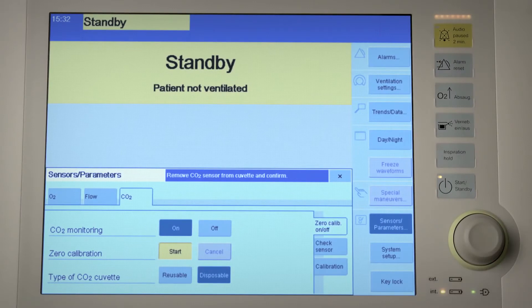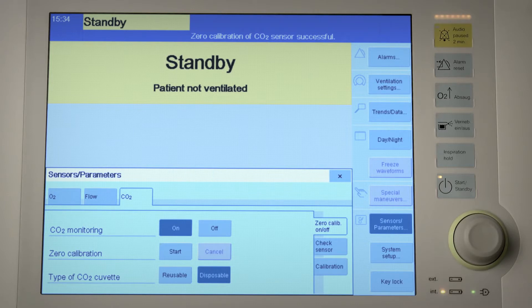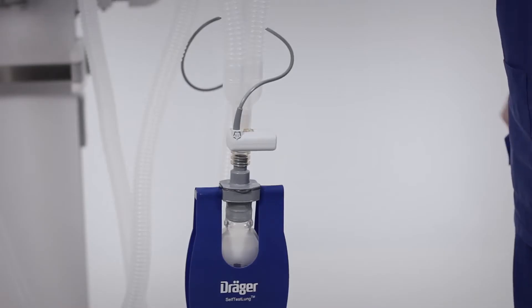If CO2 monitoring is used, check the CO2 zero indication. The prerequisite for that is a clean CO2 sensor placed on the cuvette. Use a clean or a new cuvette. At least a three-minute warm-up phase for the CO2 sensor must have elapsed. Select the cuvette type and display CO2 measured values as a curve in the configuring curve field.